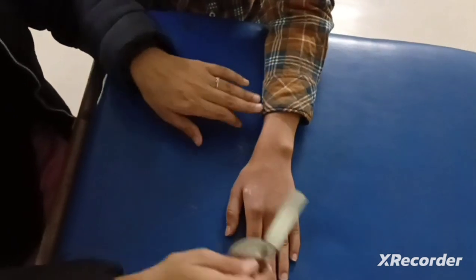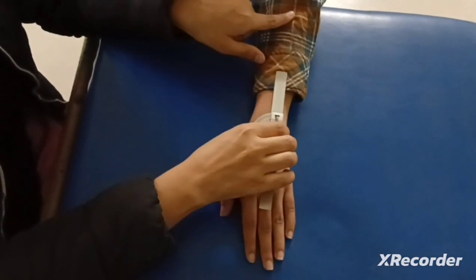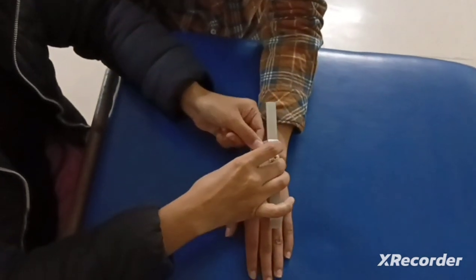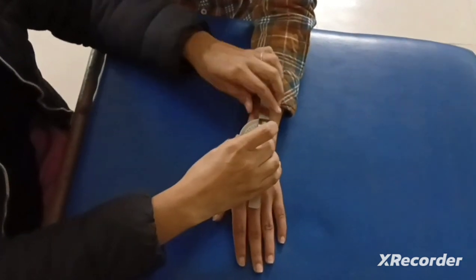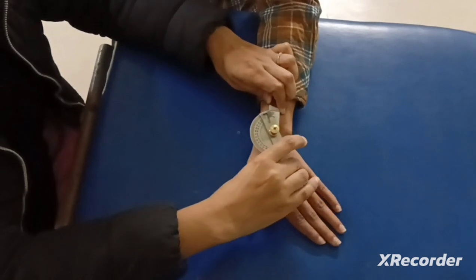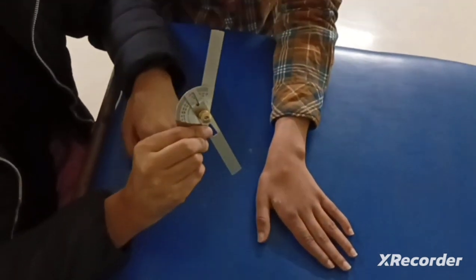So for the wrist ulnar deviation, the goniometer placement: the fixed arm will be parallel to the midline, the fulcrum will be at the wrist over the capitate, and the movable arm will be parallel to the third metacarpal line. Now ask the patient to do the ulnar deviation. So this is the goniometry of the ulnar deviation.